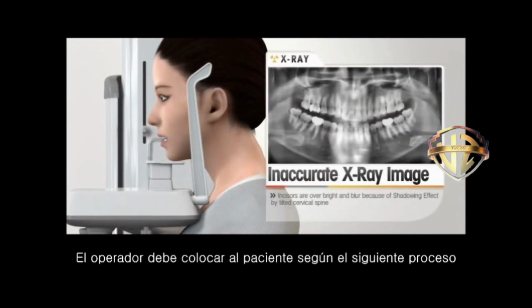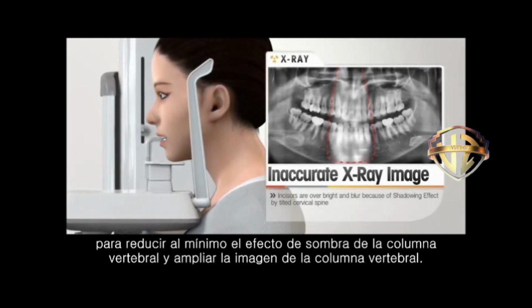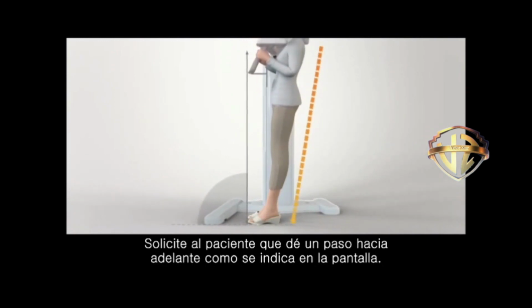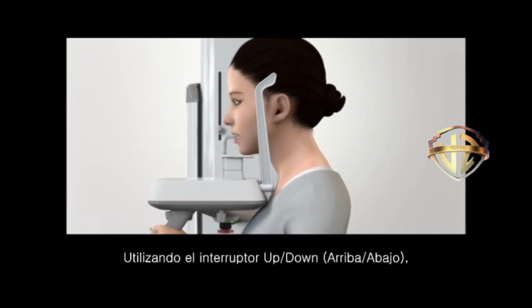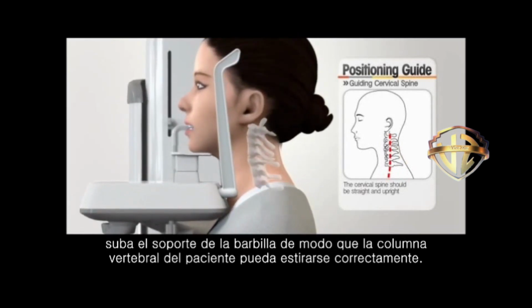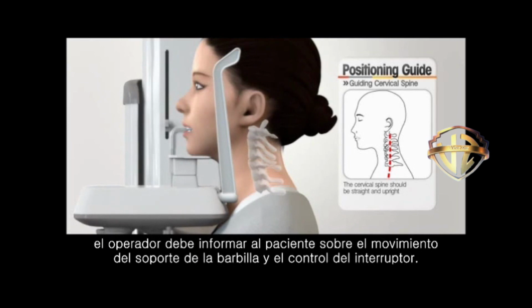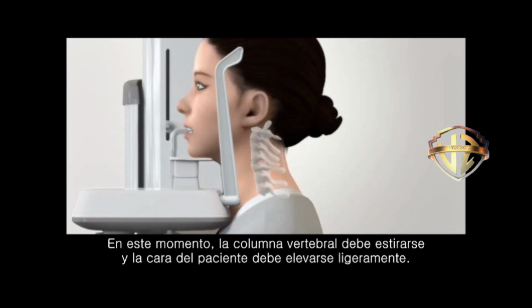Operator should position the patient according to the following process to minimize shadowing effect of the spine and stretch the spinal image. Ask patient to step forward like the screen. Bring the patient's chest close to the handle frame. Using the up-down switch, raise the chin support so that the patient's spine can be properly stretched. Before pressing the up-down switch, operator should inform the patient about the movement of chin rest and control the switch. At this time, the patient should be stretched up and patient's face is raised slightly.